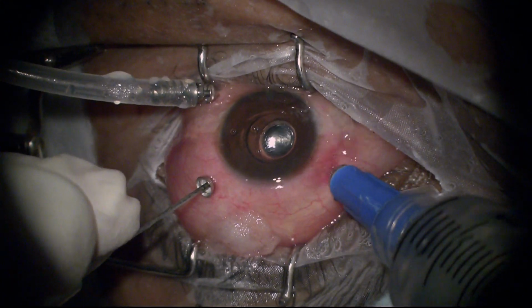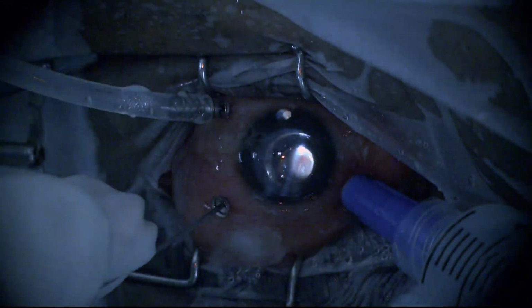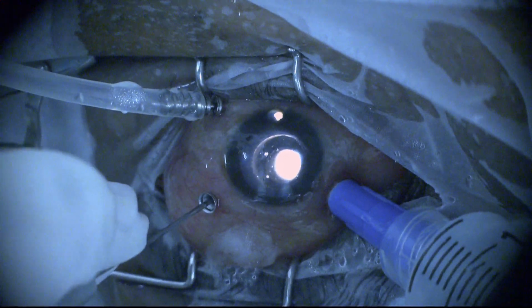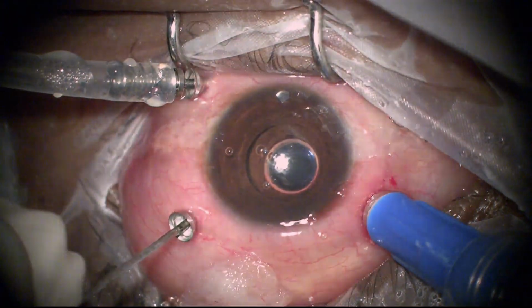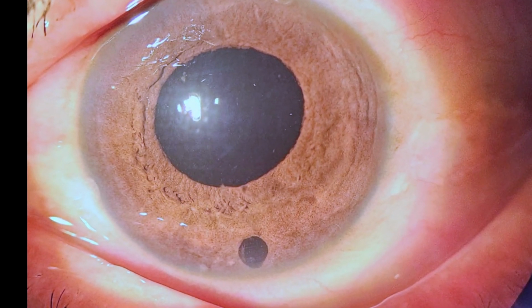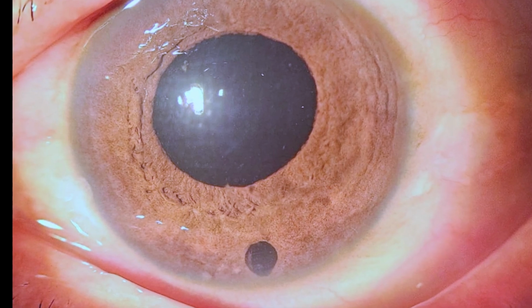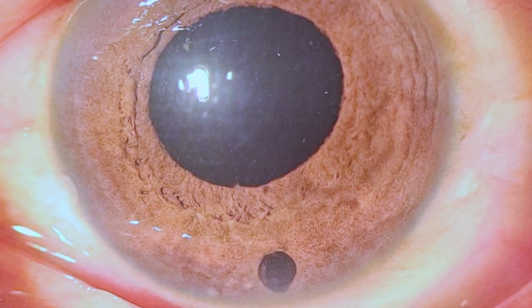Proceeding on to injecting silicone oil in the cavity, and this will fill up the space and provide a long-term tamponade for maintaining this settlement of retina. This is the day 1 post-op picture, which shows a round pupil, an inferior iridectomy, and a retina which was settled, although the view was not very clear because of some haze.